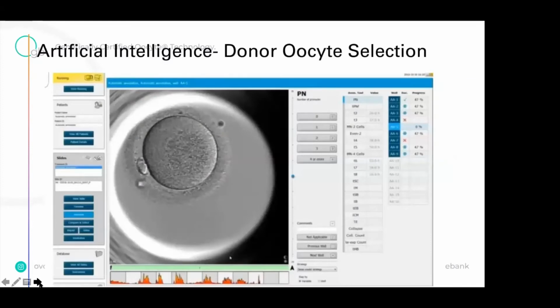When we get exactly one quality oocyte, we do the final determination by the artificial intelligence under time-lapse. We are totally sure about the compact polar body, the cytoplasmic activity, Zona Pellucida and perivitelline space. Then we are ready to freeze this oocyte as quality one for the customer.